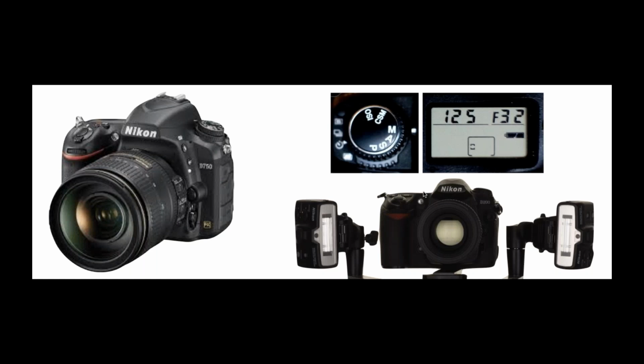As far as camera settings go, 100%, I only work in manual. I never use autofocus or any of the priority settings. I'm always working in manual. And the real reason for that is because the minute you go out of manual, the camera internally is always trying to adjust for something.